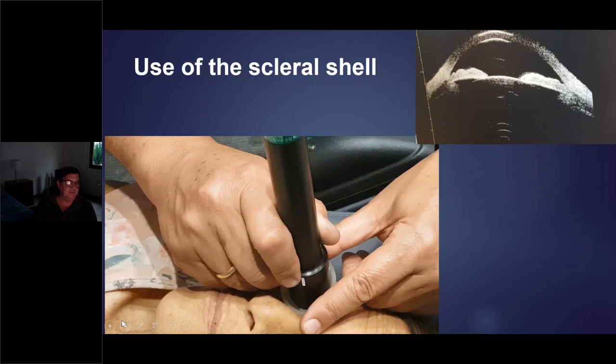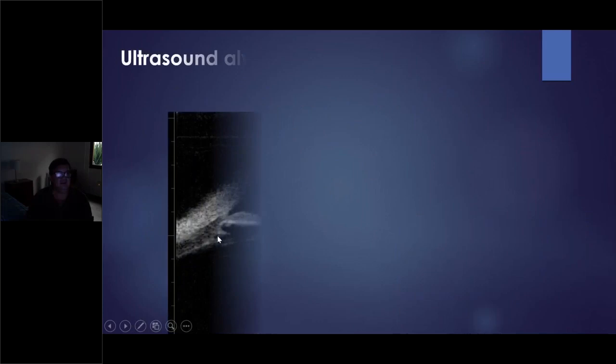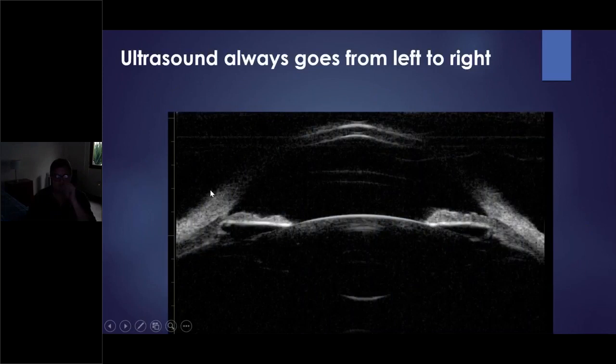Okay, it's exactly like the B mode, there is a position of the mark. The mark in this case shows the right side of the screen always. Look, the ultrasound always goes from left to right, always. And when I get this image, I know that the probe marker is facing this part. I mean, if I put the marker facing nasal, this is nasal. If I put it on the other side, this is temporal. If I put the marker up on the right side, this is so easy. I can do that. And then the focus is in the area between the dotted green lines.